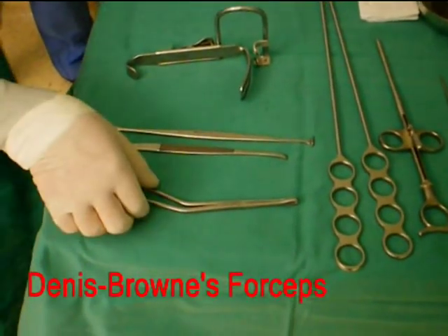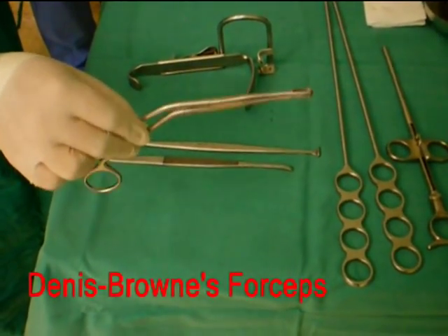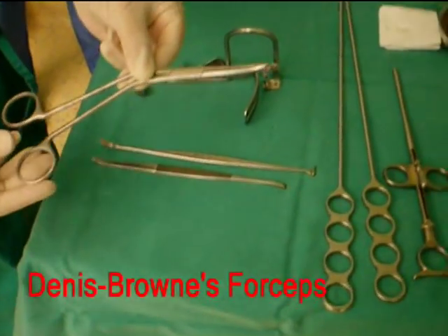There are several instruments needed for a tonsillectomy. This is a Dennis Brown's forceps, used to hold and retract the tonsil.